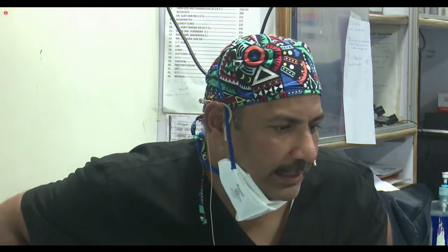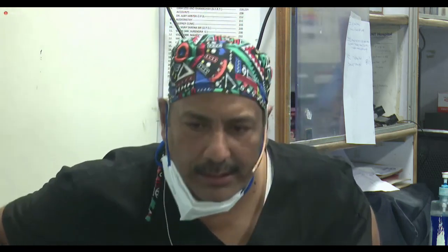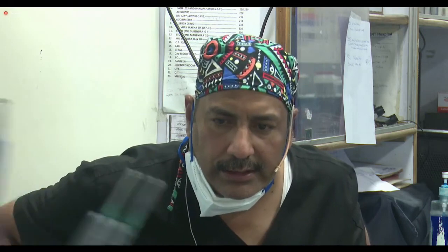The Draf area, the frontal sinus where we are operating, is the safest zone. The only challenge is the skull base, which is determined by the olfactory neurons. Don't go behind that, and do anything you want to do. Initially, you may cause some damage to the skin or a buttonhole, but that's not a big complication. You can put a suture outside, nothing more than that. It is a very safe zone, and you can practice on the cadaver sometime to get used to that anatomy. The best part is that the entire process is done with a 0 degree telescope, so you don't come across any disorientation easily.